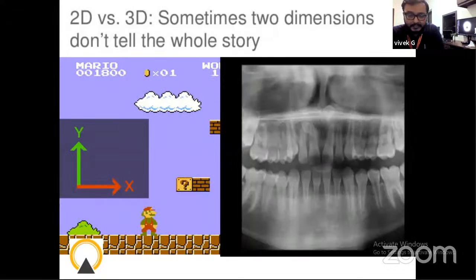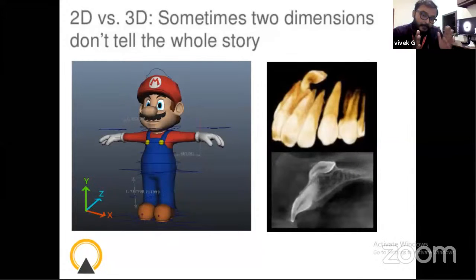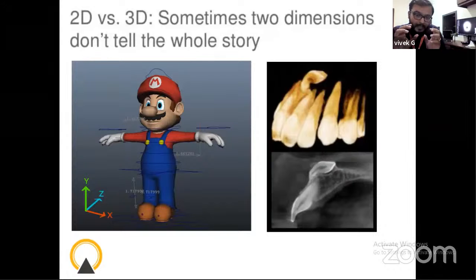I'll go back to the other slide. You can see a radio opacity on the apex of tooth 1-1, and in the same image, you can see that there is a mesiodens on the apex of tooth 1-1, which is buccally placed, inverted such that the coronal portion of the mesiodens is towards the nasal cavity. It is dilacerated. There is a bend at the cervical third of the root, and it is away from tooth 1-1.